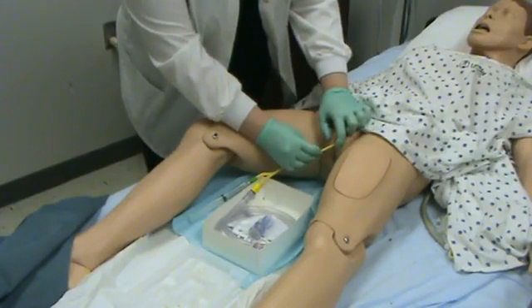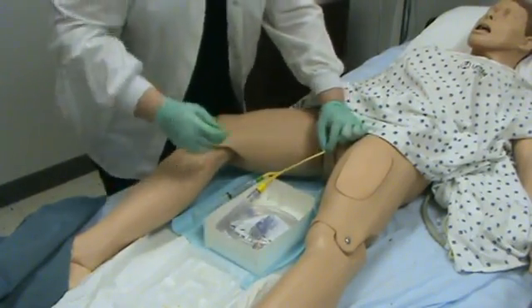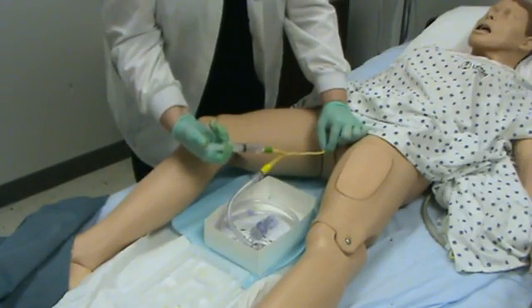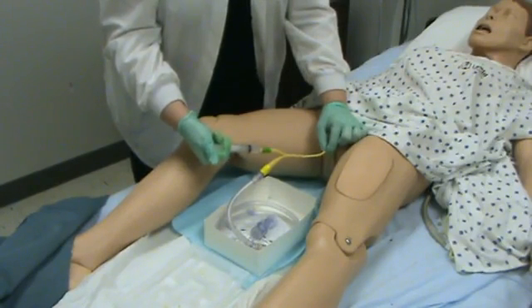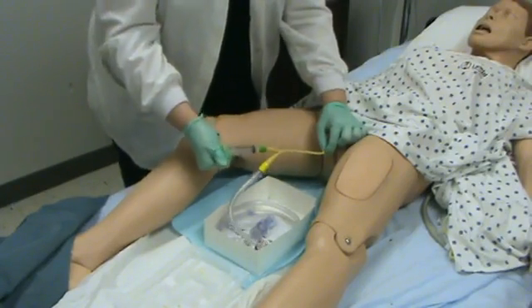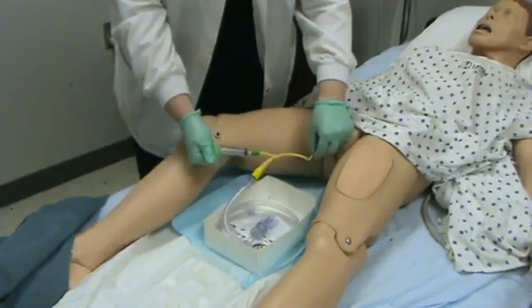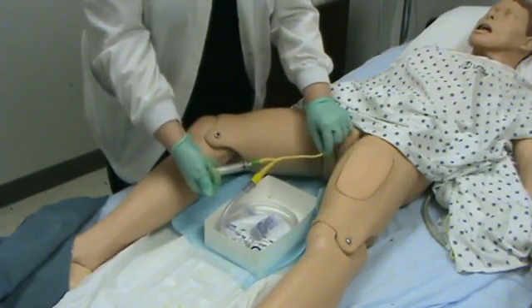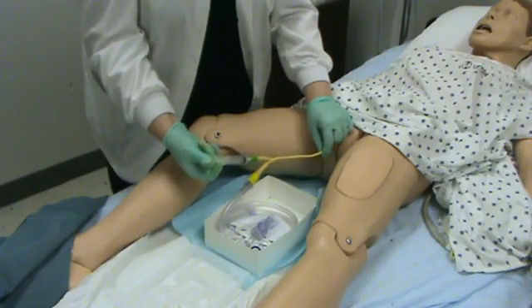Then I can remove my hand from the labia, pinch, and grab down here about an inch below the meatus. Come back here and go ahead and insert your sterile saline to inflate the balloon. While you are inserting that, make sure that you are asking your patient if they are feeling any discomfort — notice their face grimacing. Go ahead and put all the water in. You need to maintain pressure on that syringe. Pull back slightly on the catheter, not real hard, to see if it is in place. If you let go of the syringe, the water is going to fill up and come out of the balloon, so make sure that you maintain pressure on that.